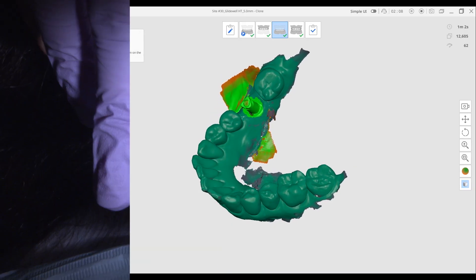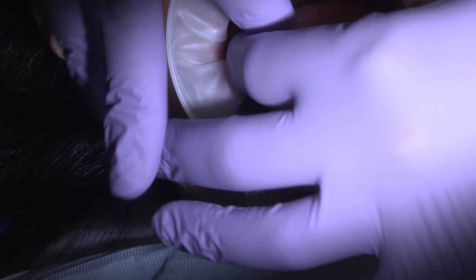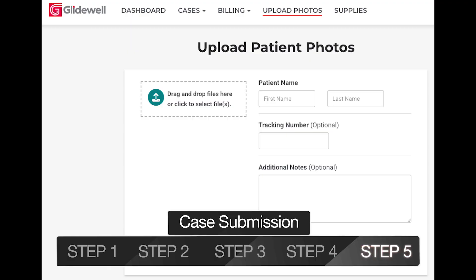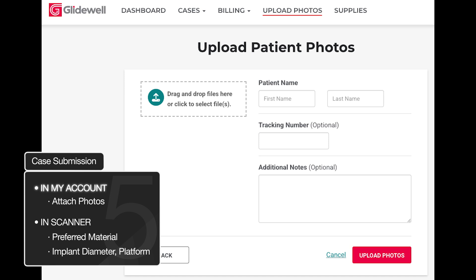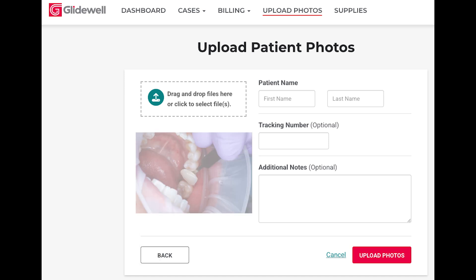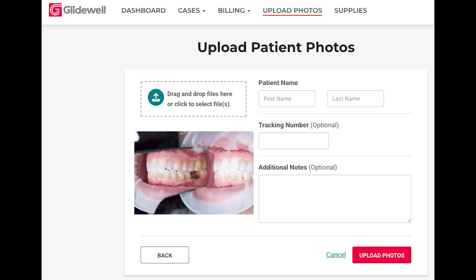Then remove the scan body and replace the healing component. Before submission, enter shade if you didn't before and attach any supporting photos. These can be attached in your My Account portal if needed. You might want to include pre-op, shade, or any smile images if it's an anterior case.